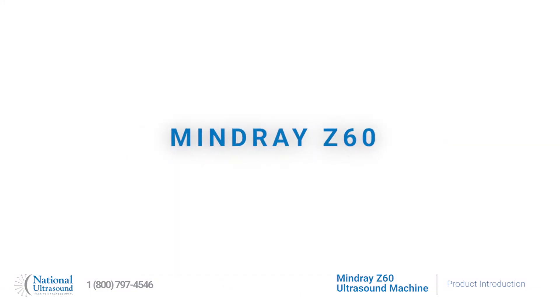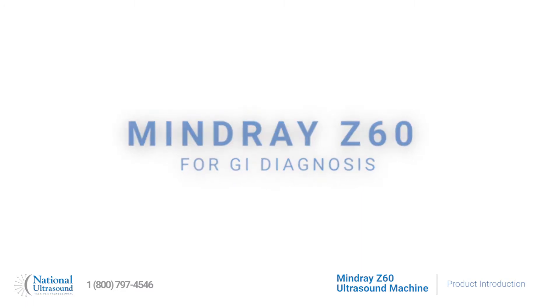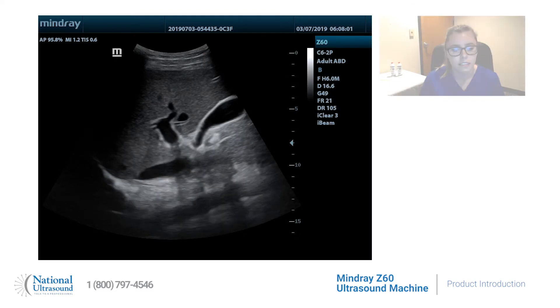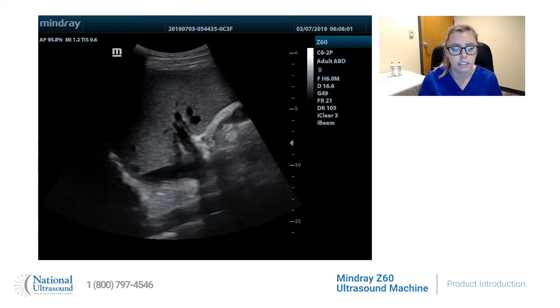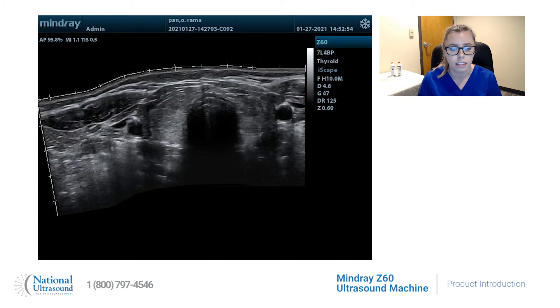The Z60 is a full solution for GI diagnosis with its full suite of probes, including the C6-2P Curved Linear Probe for abdominal scans, and the 7L-4BP Linear Probe for small parts combined with its iScape feature for real-time panoramic imaging.